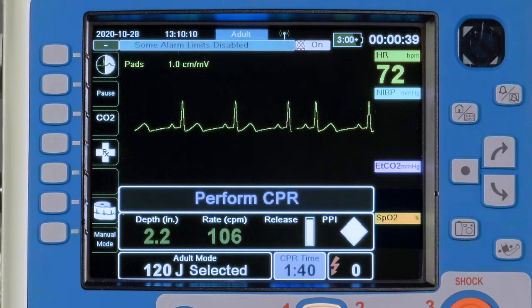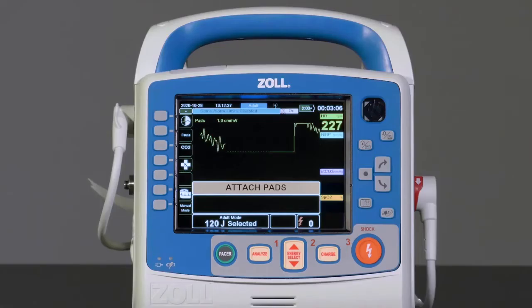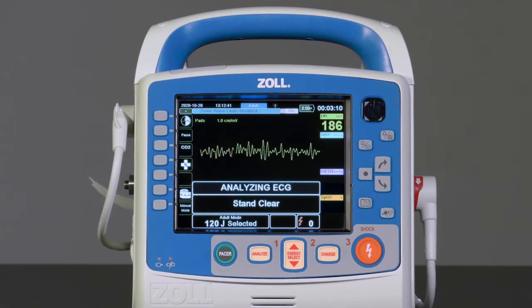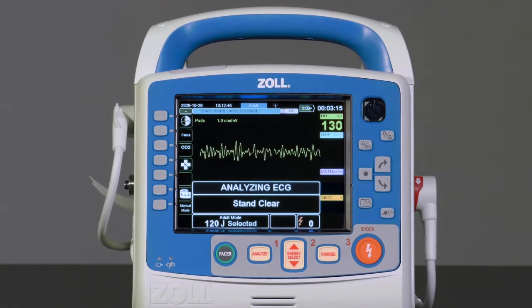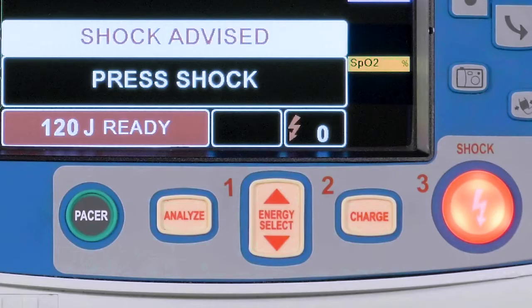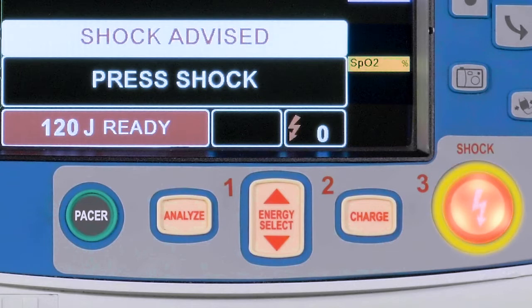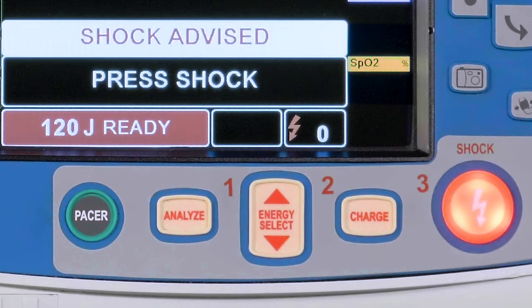If the device indicates Shock Advised, the red Shock button will illuminate along with the message and audible prompt: Press Shock. Based on configuration, the shock needs to be delivered within 30 or 60 seconds before the device automatically disarms itself.